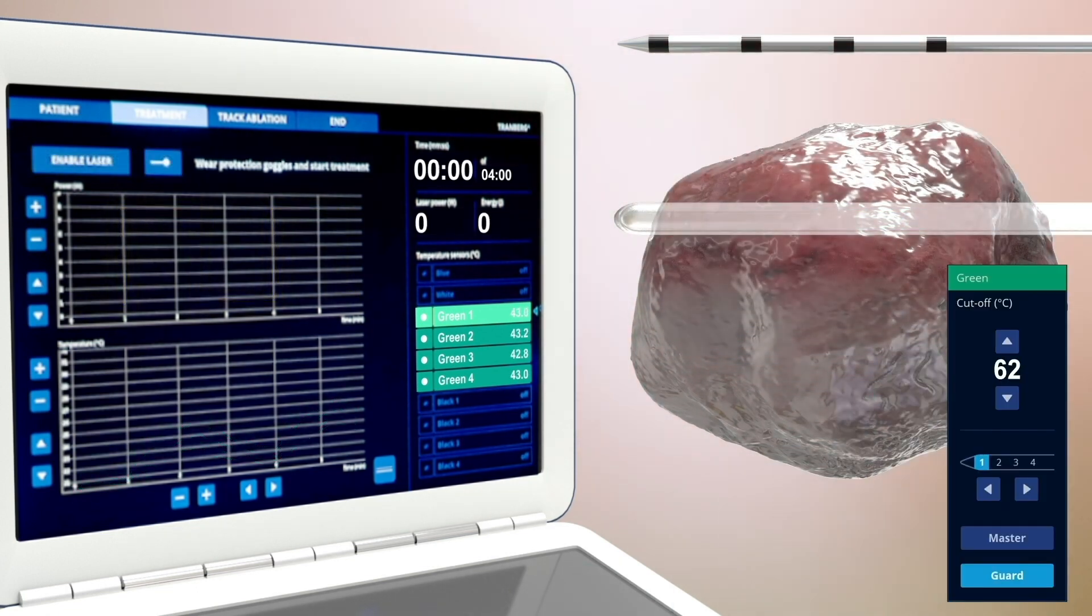The system is also equipped with a guard function that can be used to automatically shut off the laser when the target temperatures are reached, as well as help protect vital structures.